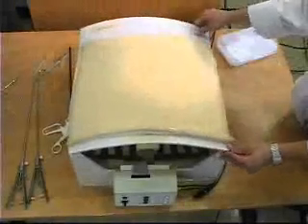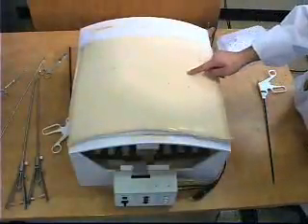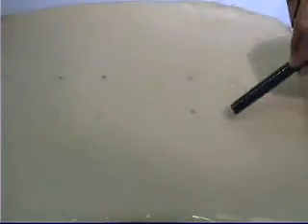The EndoTrainer box is covered with a simulated skin, which has 8 preset defects in it in which to place trocars. The operator may choose to place the trocars in any of the sites and may vary them according to the task, but the operator must also avoid placing trocars in such a way that they would interfere with each other.